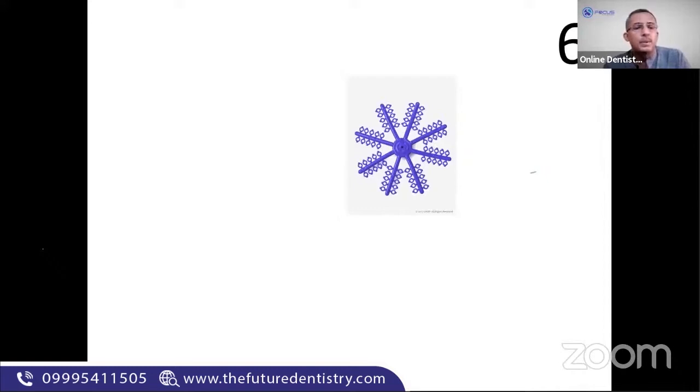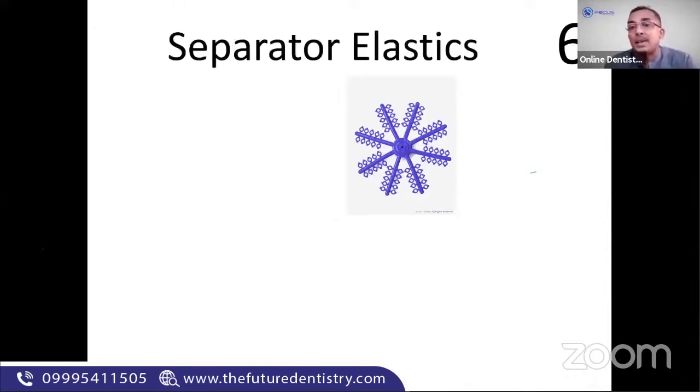Nobody knows what this is. Modules, yeah, that is exactly what they also want to know. Modules, these are not modules, okay? If you look carefully, these are called separator elastics. Those are bigger ones than the modules. I'll talk about modules pretty soon.